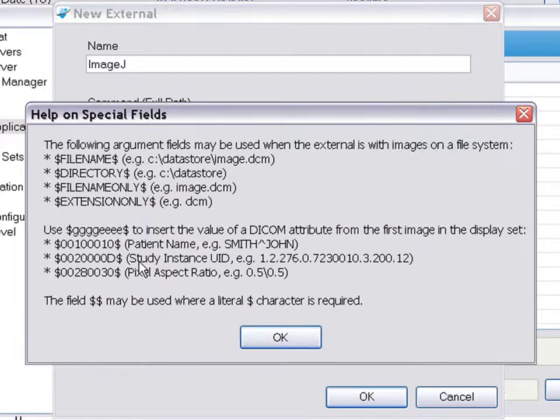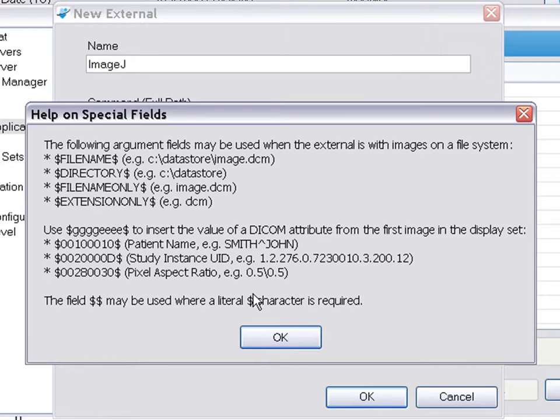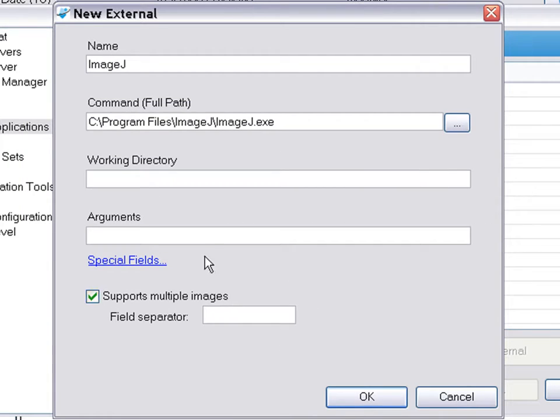ClearCanvas provides special fields for passing file names or DICOM information to the command line. In this case, I'll use file name.